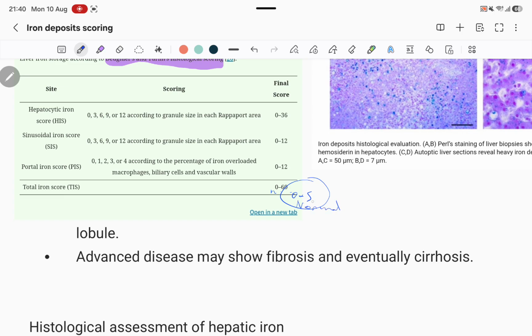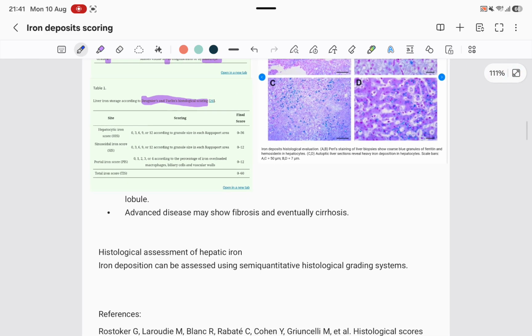Above 6, or 6, that is abnormal, okay? And then after that, that is just severity, I guess, but we cannot really put something that they didn't mention, so I have no idea. It could be that it's just mild, moderate, severe, but I'm not really sure. I couldn't find anything.